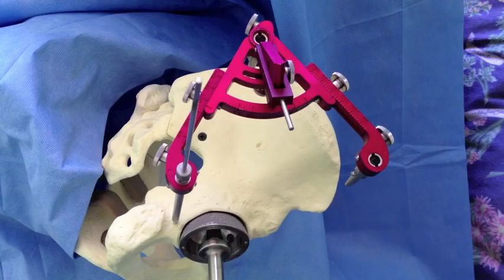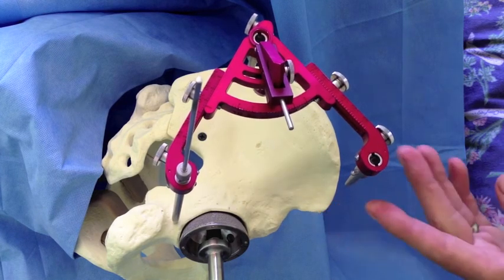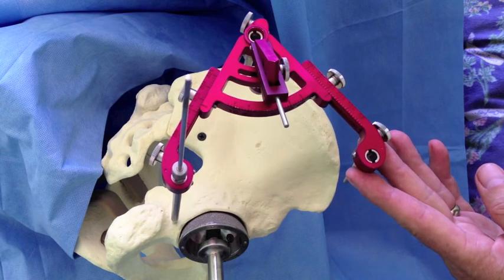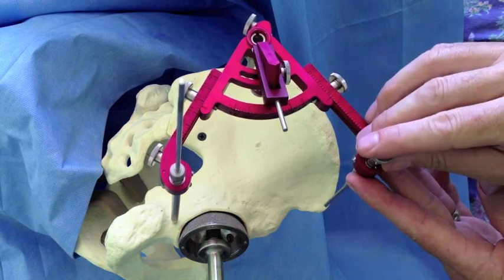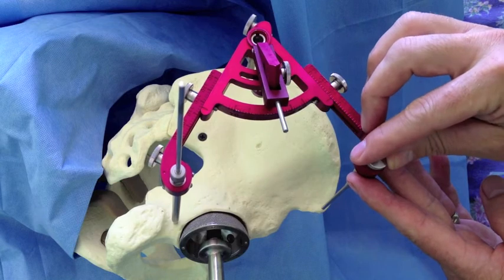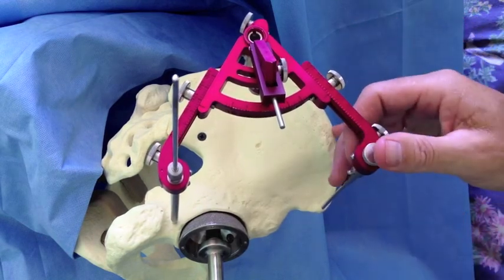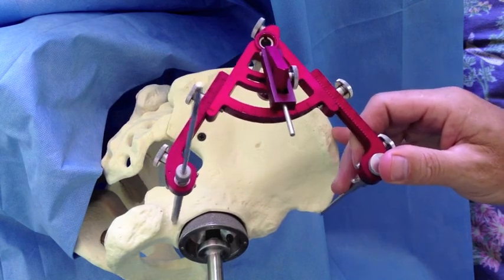Once the base point leg is docked, feel the anterior superior iliac spine and align the anterior cannula to aim directly at the lateral edge of the ASIS. Insert the sharp trocar percutaneously, either by making a tiny incision or by accelerating the pin rapidly. Lock the trocar into the cannula and move the tip of the trocar to probe the edge of the ASIS.